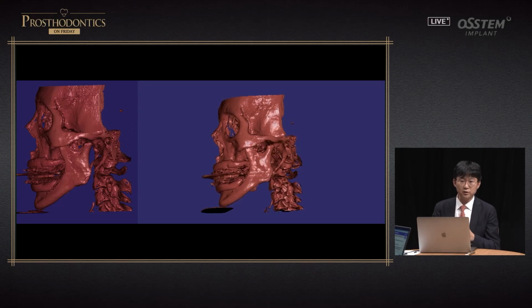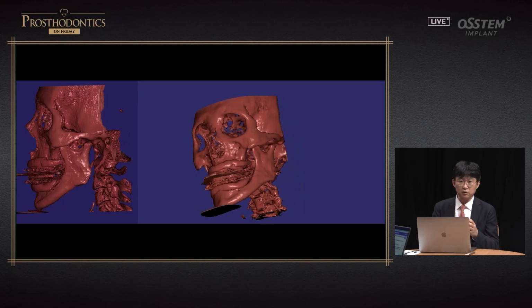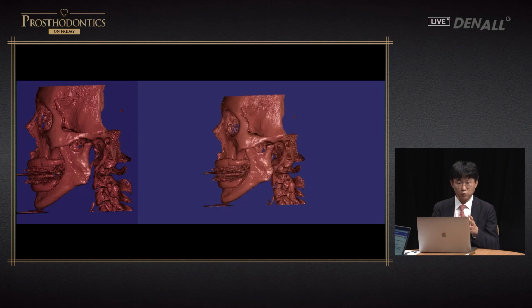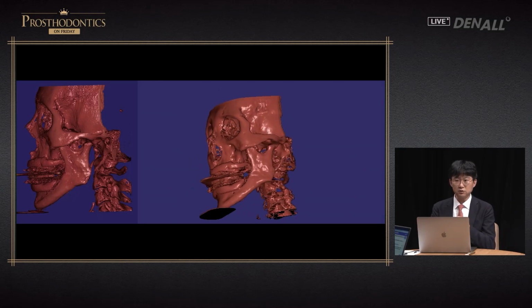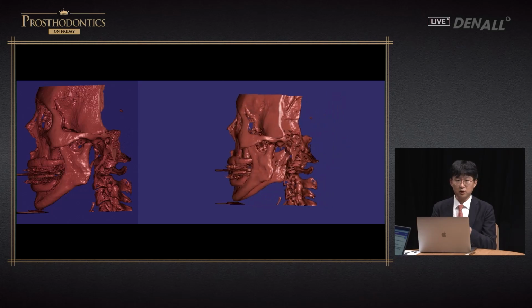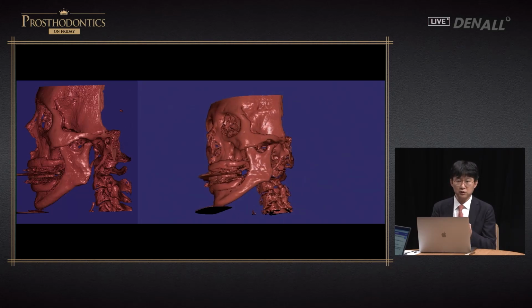It is far from the apex. If you look at the patient's CT, the patient is biting on the tapping point where the joint is dislocated. The joint posteriorly enters when Gothic arch tracing is performed, but the patient's muscle is not adapted to that status. For this patient, the occlusion cannot be established on the first day.